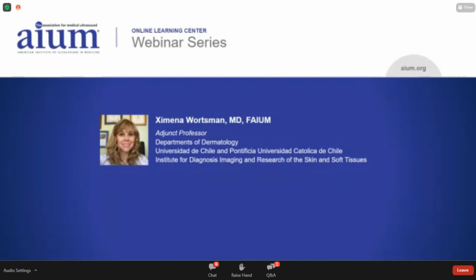Okay, sorry. Have you ever used contrast enhanced ultrasound for skin lesions? No, I haven't used it. I know of some experience from Dr. Marcio Bauer from Brazil on Merkel cell carcinoma. It is published in the literature. But for us, we didn't try it because we didn't feel it would give too much information for daily practice.